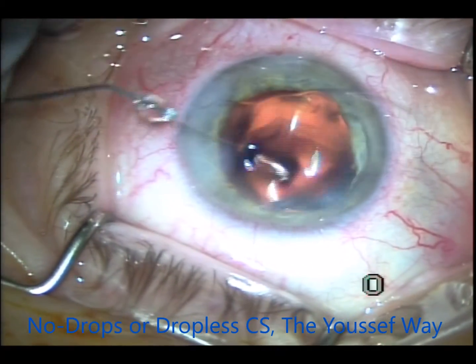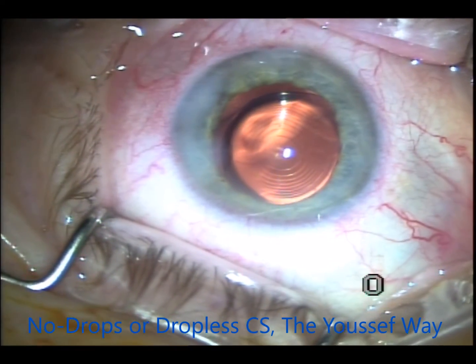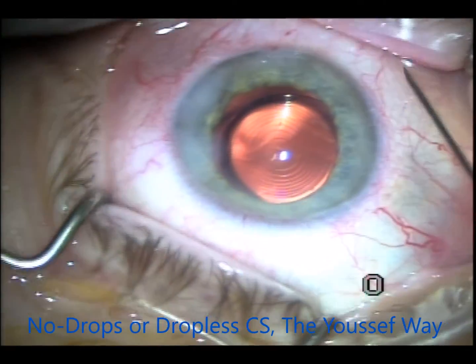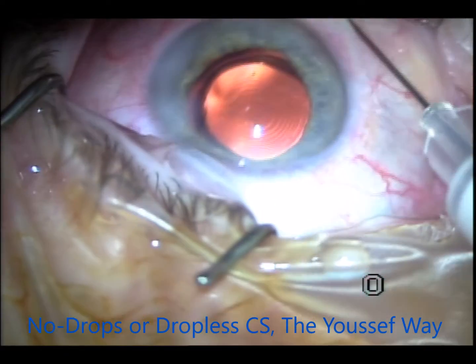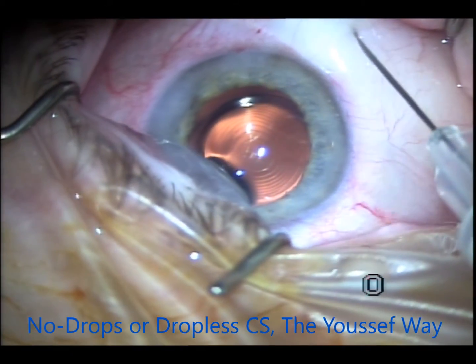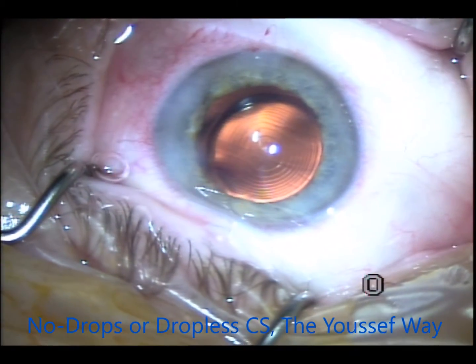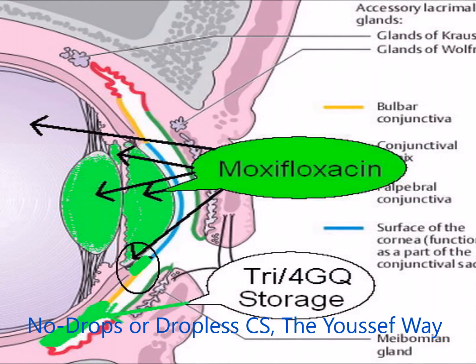You have to make sure that the eye is pressurized and the wounds are self-sealing. Start by preparing the wound properly from the beginning so that the wounds are self-sealing. If you have any doubt, you have to put a suture — I very rarely do it, but if in doubt, just put one.